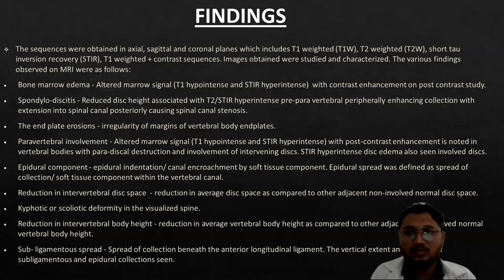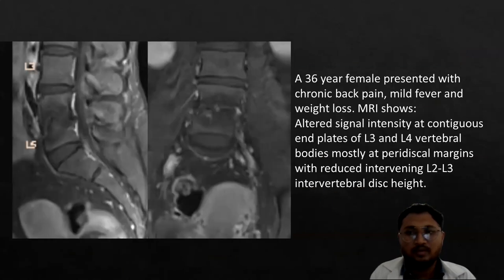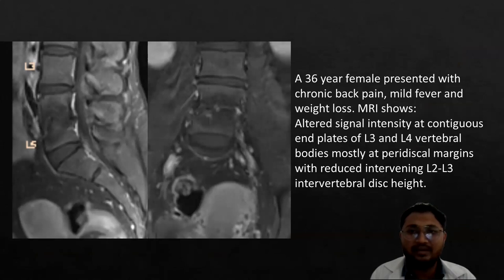I would like to show some images suggestive of various regions involved in Pott's spine. This is an image of a 36-year-old female presented with chronic back pain, mild fever, and weight loss. On MRI, we can see there is altered signal intensity at contiguous end-plates of L3 and L4 vertebral bodies, mostly at the paradiscal margin, with reduced intervening intervertebral disc height.